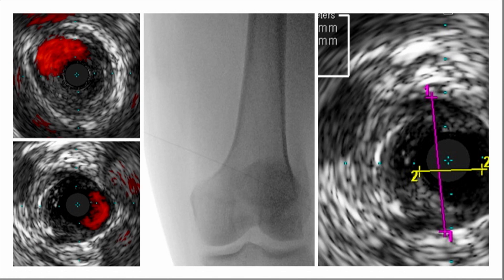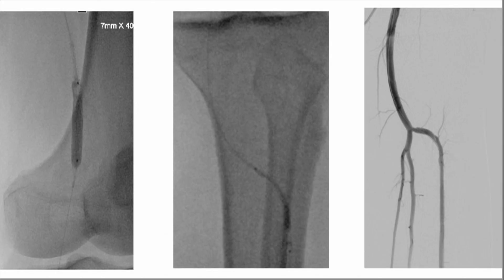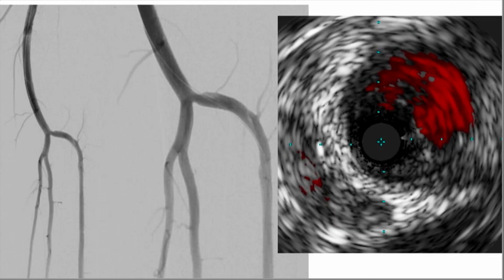Looking at these IVUS images, you can see how much more disease there is. It's not a very calcified vessel as seen in the static image, but there is a significant obstructing stenotic plaque and you can appreciate the true lumen. We ballooned it with standard high-pressure balloons and scoring balloons in the anterior tibial artery as shown in the middle image. The angiogram afterward looks pretty good on the surface, but when you use IVUS, the far right image reveals a significant dissection flap.